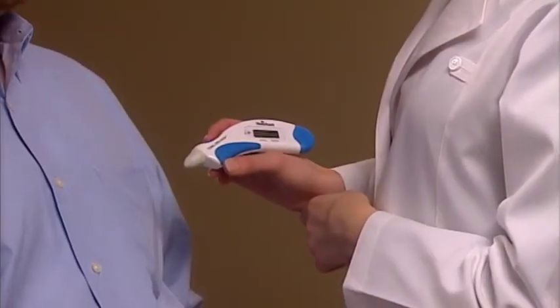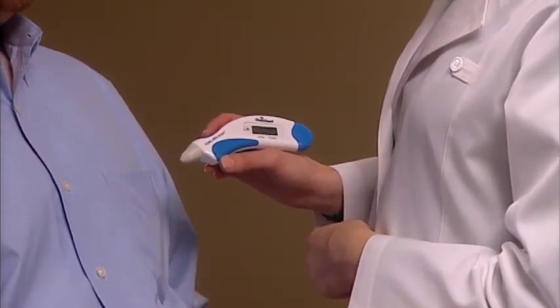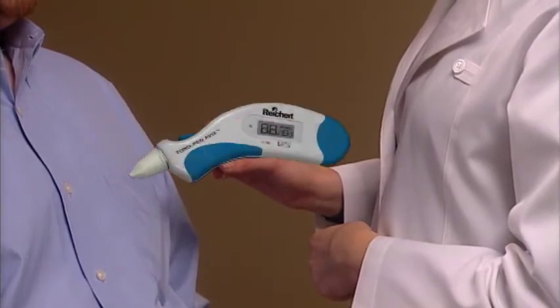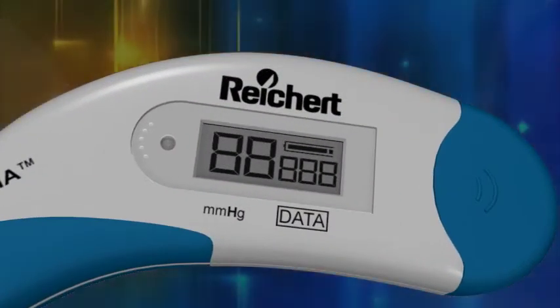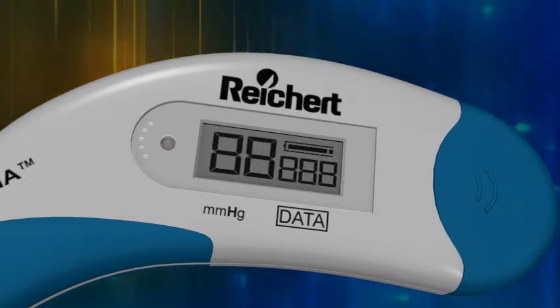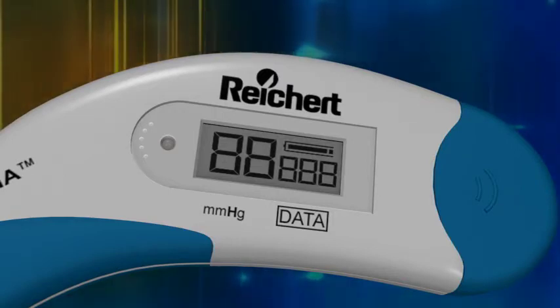If your patient is prepared, you are now ready to start the measurement process. To initiate the test, press the blue operating button one time only. The Tono-Pen AVIA will beep and five eights along with a battery life indicator will be displayed briefly in the LCD, indicating that the Tono-Pen AVIA tonometer has passed the initial self-test.